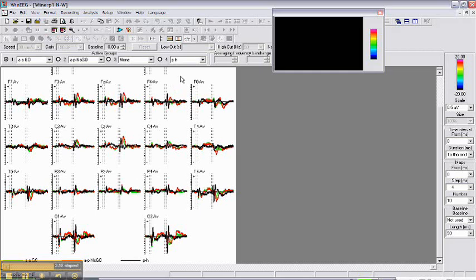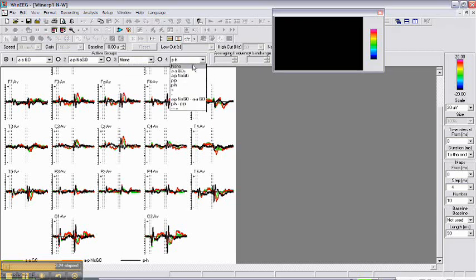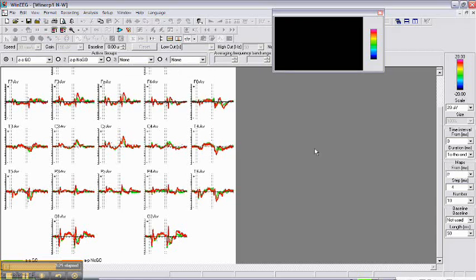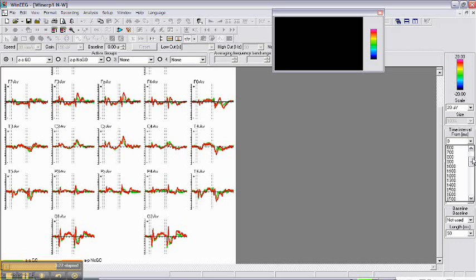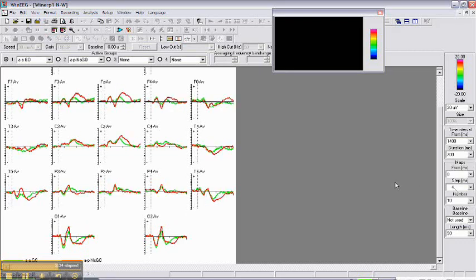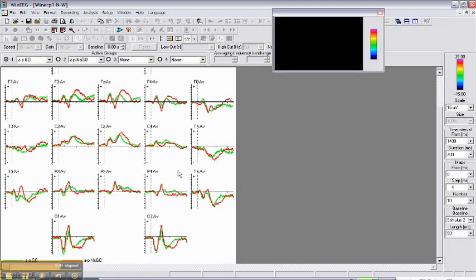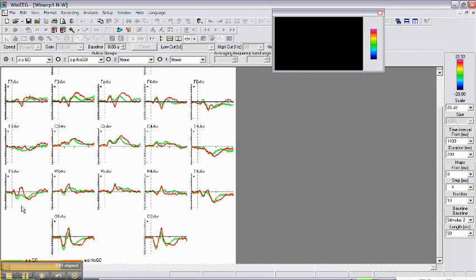This is ERPs computed for this subject. Let's select the second stimulus presentation and only go, no-go condition. So this is ERPs for go, no-go condition. We will correct the baseline from the second stimulus presentation.